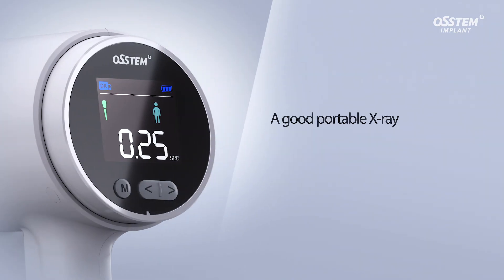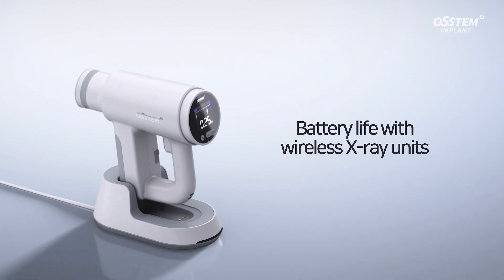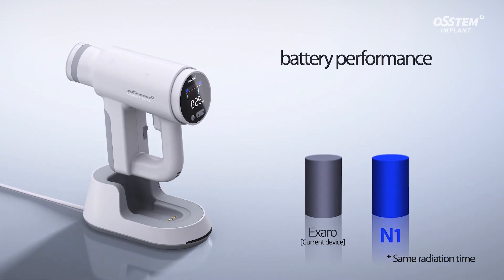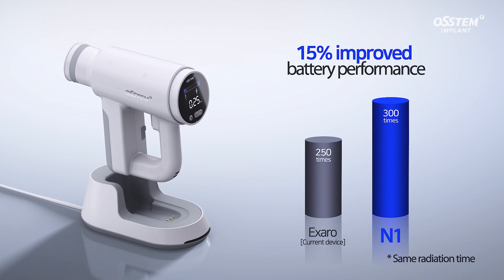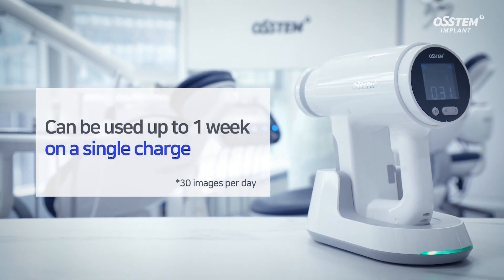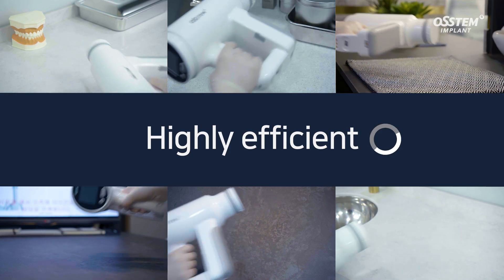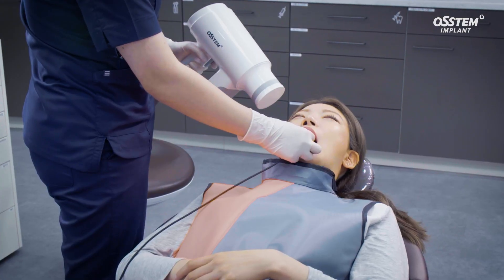A good portable x-ray should have a long-lasting battery. With 15% improved battery performance, the N1 lasts for a week on a single charge, eliminating problems with other wireless x-ray units. The N1 reduces the inconvenience of continuous charging, which helps improve clinical efficiency.